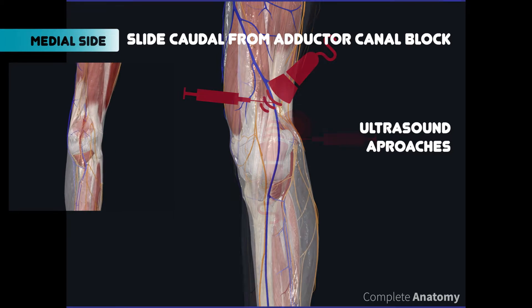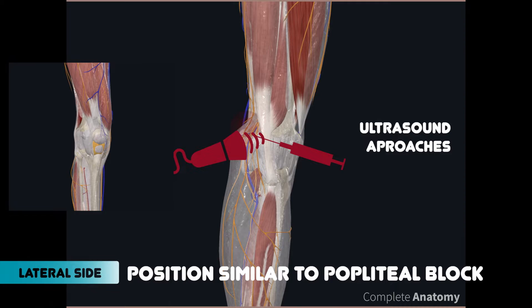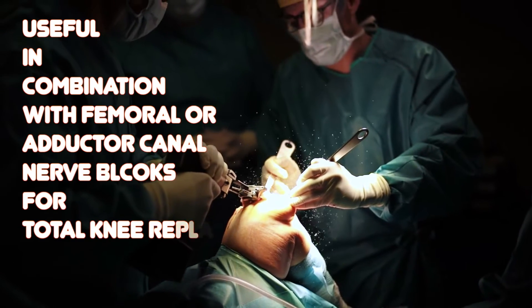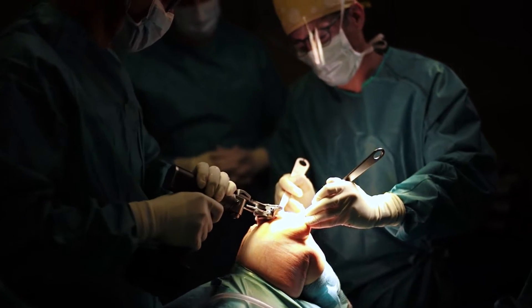This block can be placed from the medial side or the lateral side. It is useful in combination with other nerve blocks for total knee replacement and ligament repair.